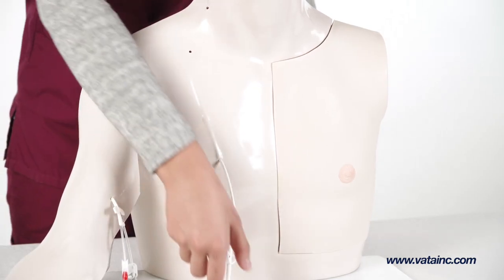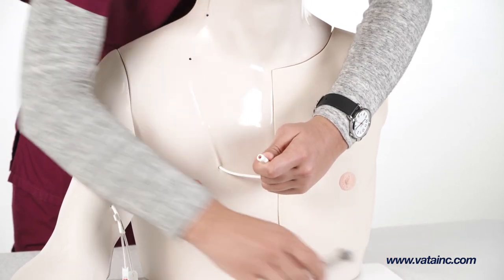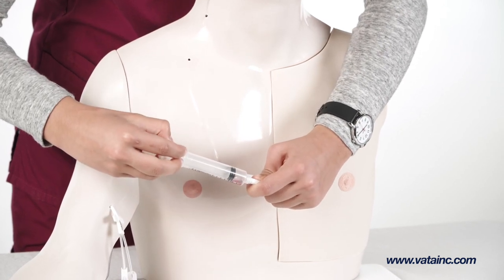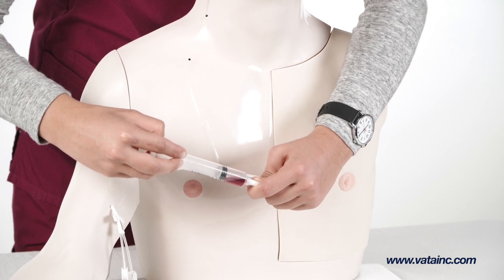To prime the tubing with simulated blood, attach a syringe to the tunneled central venous catheter and draw back to remove all the air in the line. Be sure the snap clamp is open on the catheter. You are ready when simulated blood is visible in the syringe.